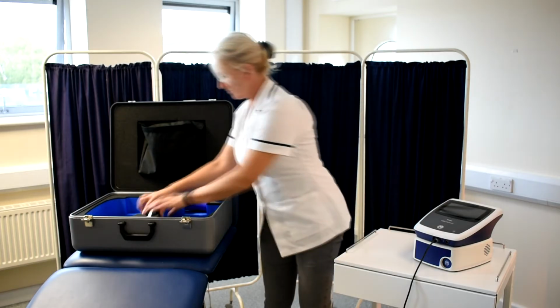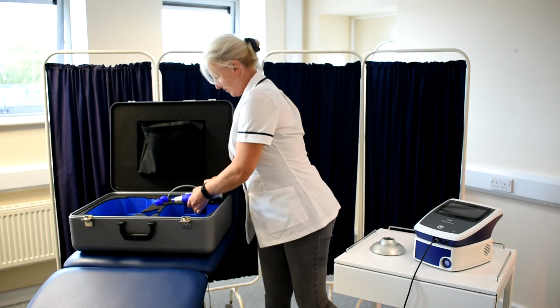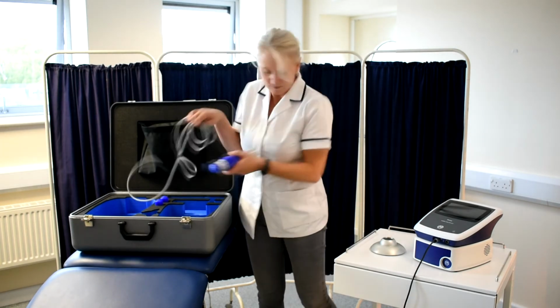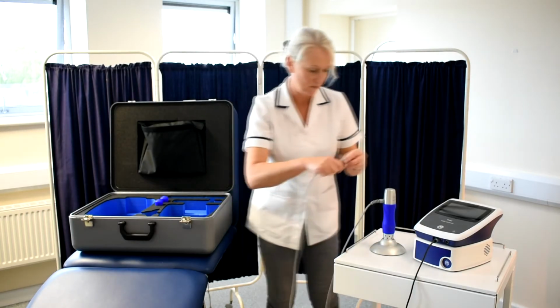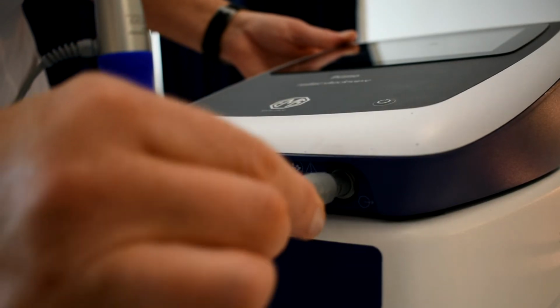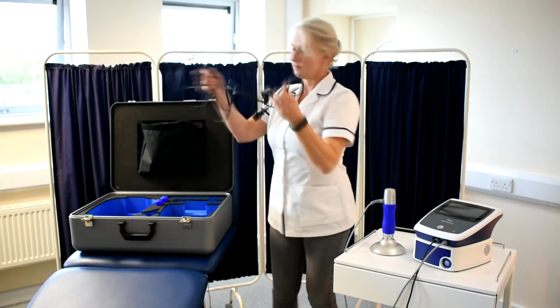Plug in both the handpiece and foot switch cables. You shouldn't get them the wrong way around, as there are different pin arrangements in each plug. The foot switch enables the therapist to keep both hands free to apply the shockwave treatment, and there is no trigger on the handpiece.